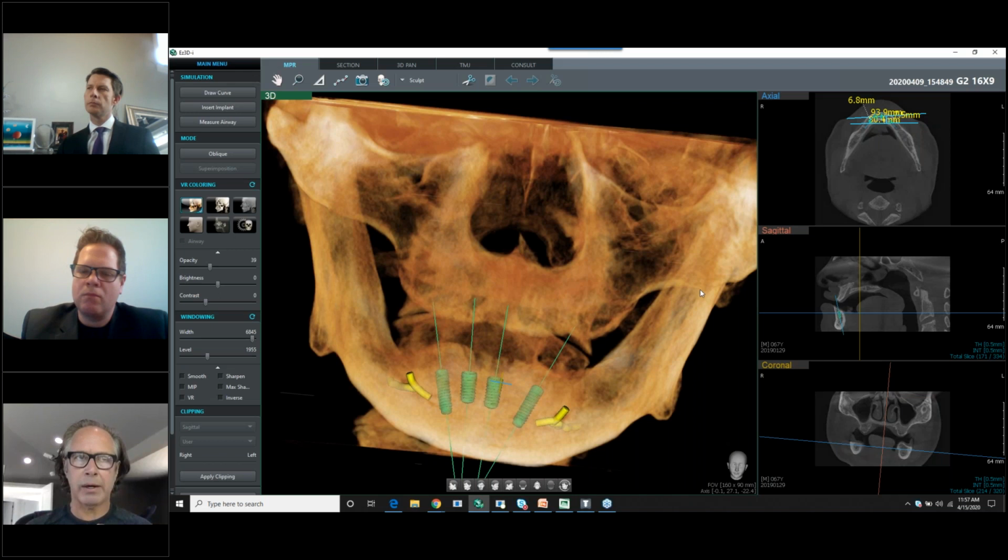Can they afford my care? It's no longer a question of convincing someone that the sinus is low or that they don't have enough bone. It's right in front of you. So pre-COVID, this was a really instrumental tool for me to start the conversation.